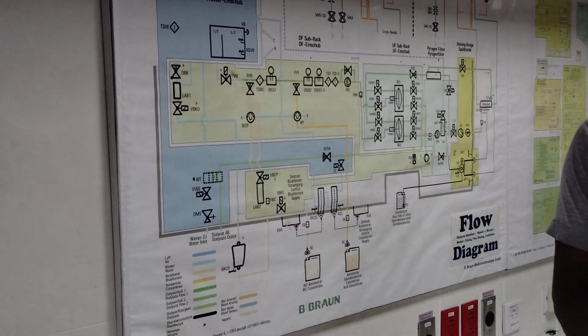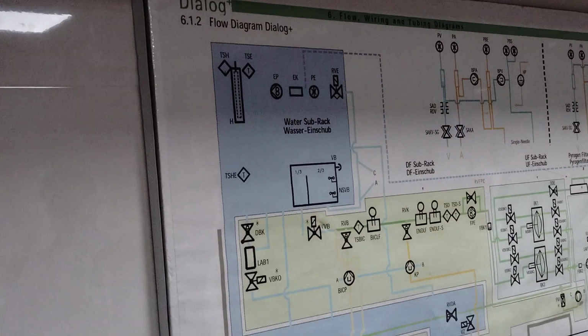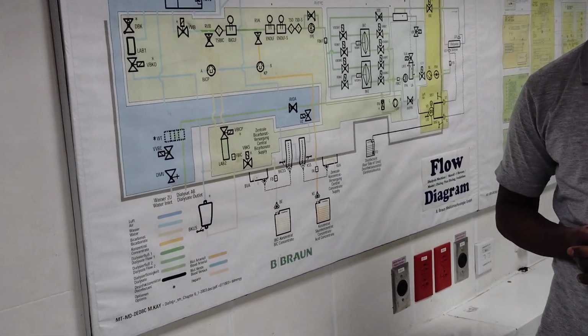We cannot just prepare it and keep it like this. It will get contaminated. That's why in the early stage they gave us the can. So we have to prepare the powder daily. We are cleaning the powder. We have to prepare it ourselves. What's the purpose of this one?